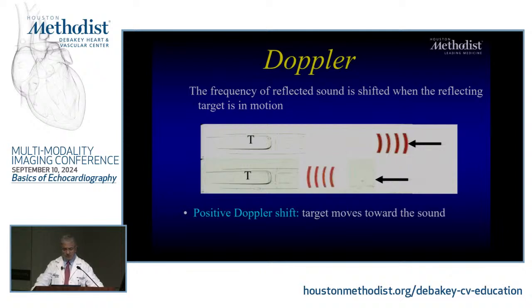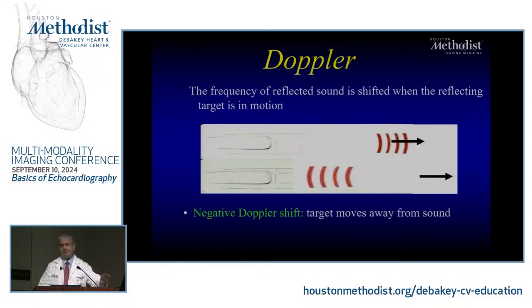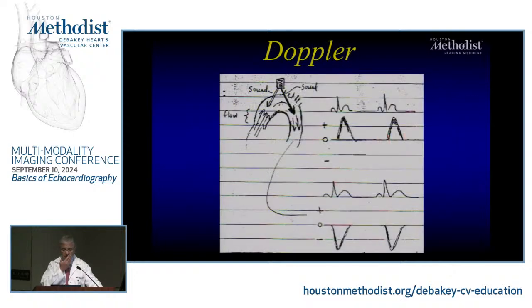All right? So that's the principle, okay? Positive shift if the target is coming towards you, and a negative shift if it is going away from you. Which means if you're perpendicular to it, you're not going to have any shift. It will be exactly the same frequency.